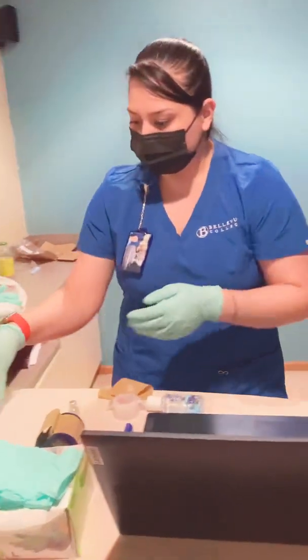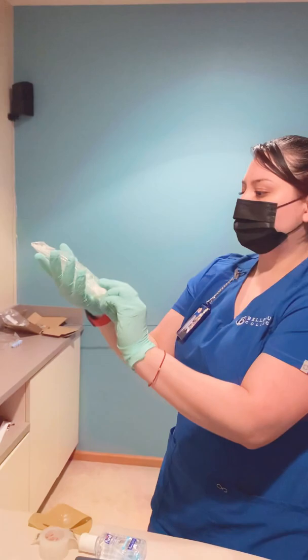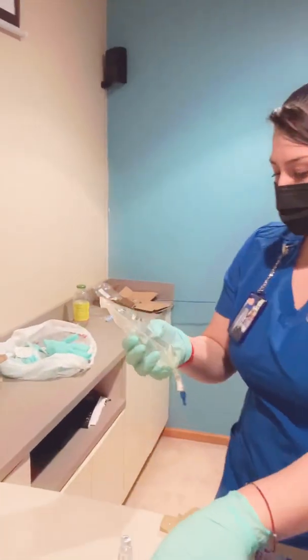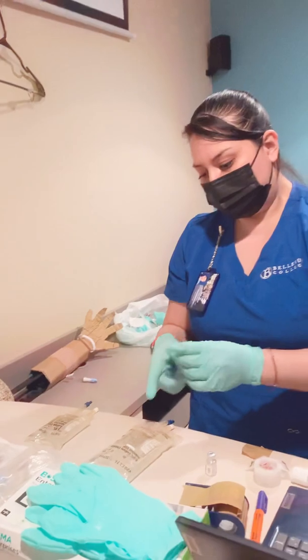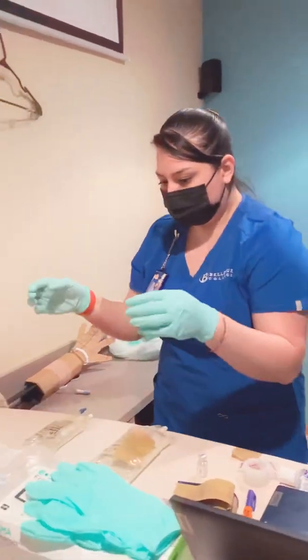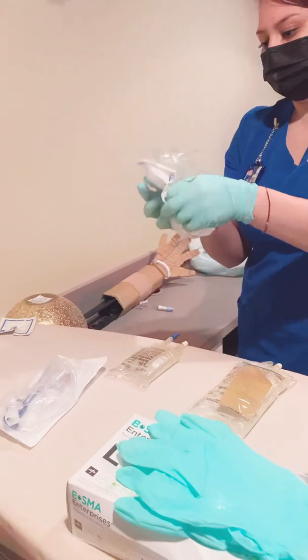And I'm going to check my bag's color, clarity, and expiration date. Looks good. I'm going to scan it into the MAR, and I'm going to scan the patient's wristband, and I'm going to then label it with the route, the time, my initials, and it's for urinary tract. Okay, and then I'm going to open my primary IV set.